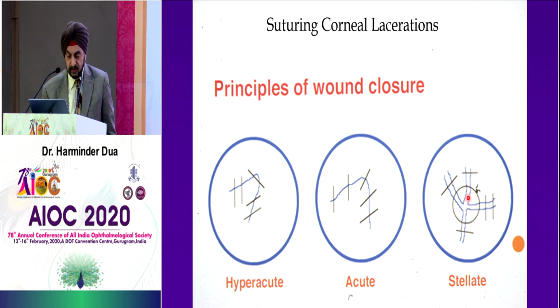And inside here, you can pass a running stitch through the stroma all the way and bring it out of the wound, tighten it, and then you can roll it away from the wound. And usually this one is completely buried and you don't take it out. If it is still leaking, then this thing here is to remind me to tell you that you take a bit of cyanoacrylate glue or a fibrin glue, and again Dr. Syed will tell you much more about that.